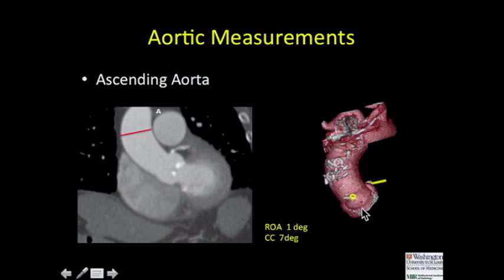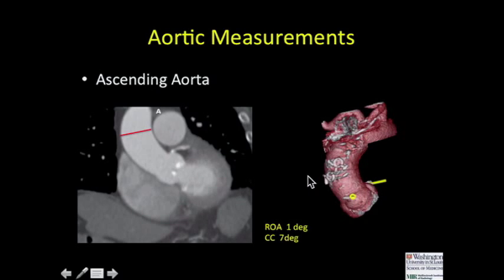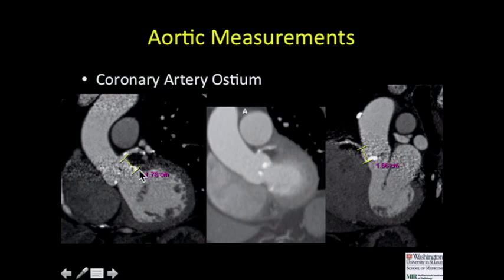Our cardiologists also like us to provide a 3D representation of the valve planes or valvular leaflets in the same plane, simulating what would be seen on cardiac cath — with the right cusp, left cusp, and non-coronary cusp in plane. That provides measurements that serve as a starting point for positioning the device. We also provide measurements from the valvular leaflet attachment to the coronary ostia for both right and left coronary arteries, ideally greater than 15 millimeters so they're not covered by the device.